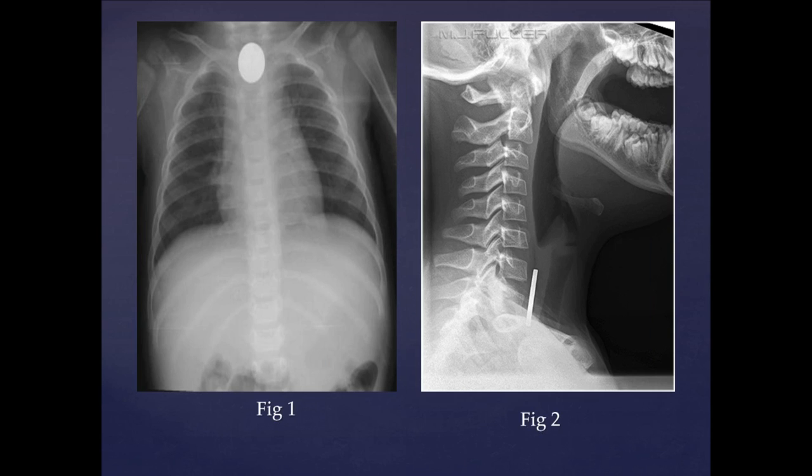So management of adenoid hypertrophy. Fifth X-ray. Here you can see there is a foreign body in the thoracic inlet, and you should count the vertebral column around the C5, C6, C7 level. So this is the AP view and this is the lateral view. This is again a plain X-ray, neck and chest. Here you can see the neck and chest. This is the neck.